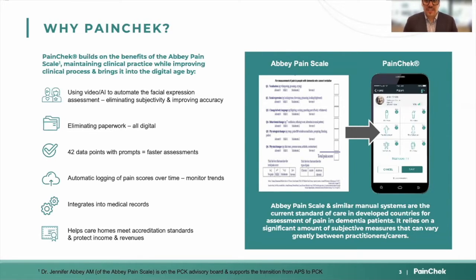Asking for the personal opinion of an assessor is always going to be a little bit fraught. The Abbey and other tools can be very accurate when used correctly. However, the skill and experience required to use those tools effectively is often something that needs to be developed over an extended period of time and can be impacted by the biases and preconceptions of the person doing the assessment, not to mention what they simply think of what they're observing.